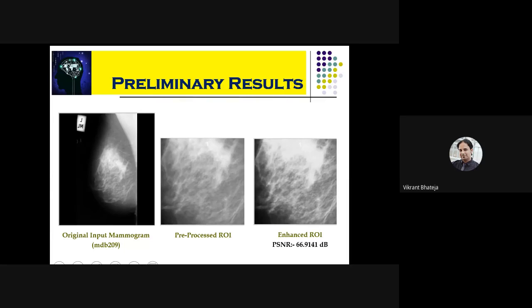So certainly it appears that something is missing over here. Maybe while compiling these results, some part is missing. This is just to give you an idea that sometimes it happens, we are doing preliminary analysis, we are working on those results. The results are quantitatively very good, but the images are not very pleasant. Then this gives you a very important suspect that you are supposed to reconcile everything now. There is something wrong over here.